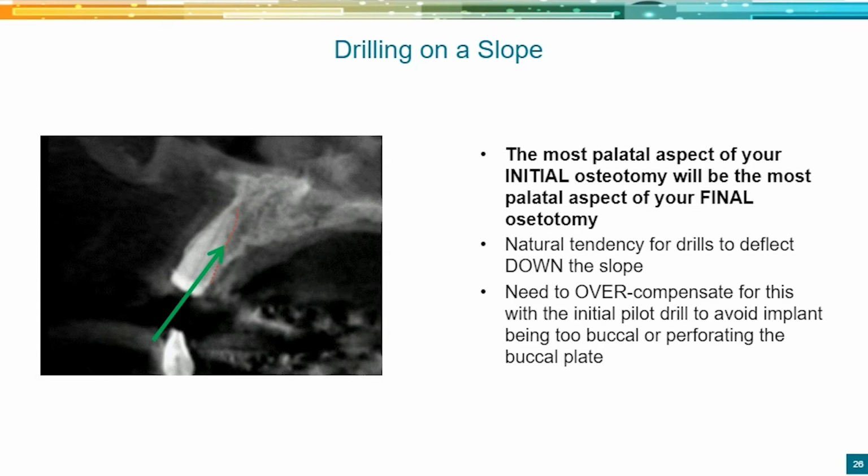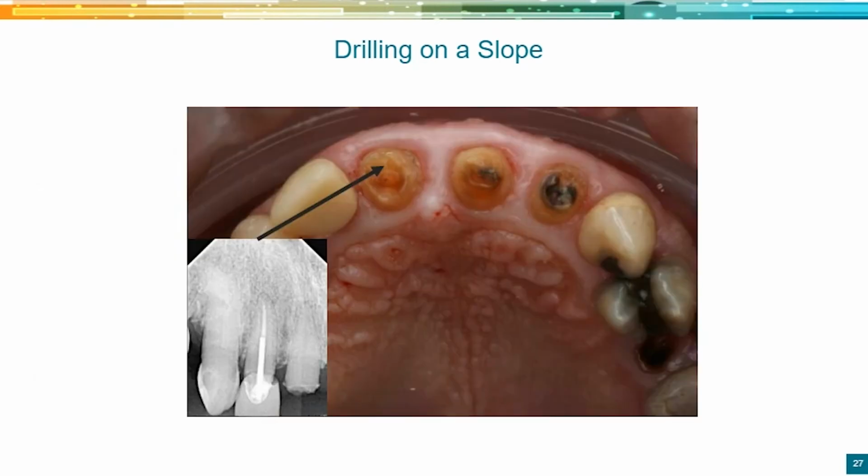Okay, so we'll talk about guided surgery and how we approach it in immediate sites like that. But it's an important concept to understand, is that when you see someone that has a broken down tooth in the anterior, you want to do it immediate, because immediates have been proven in the literature to be more successful and hold the hard and soft tissue better. So we want to do immediates whenever we can, right?